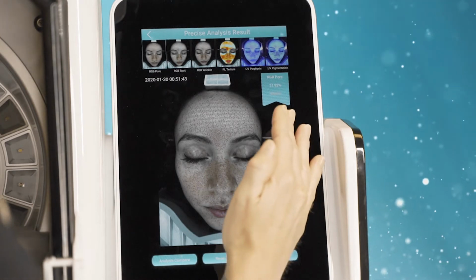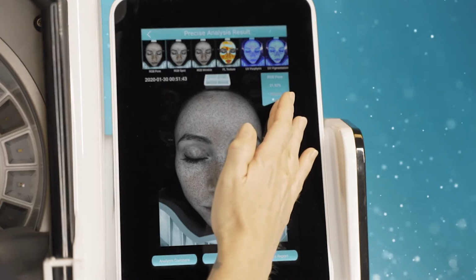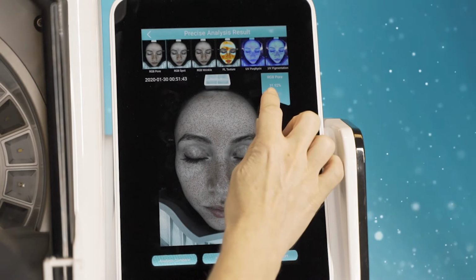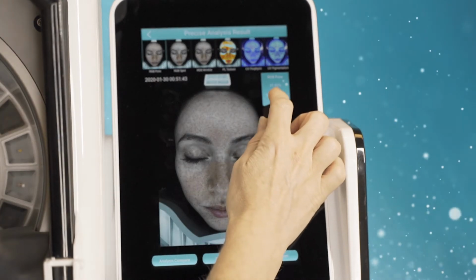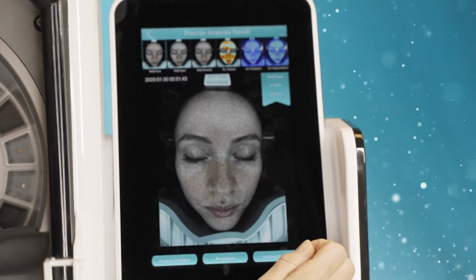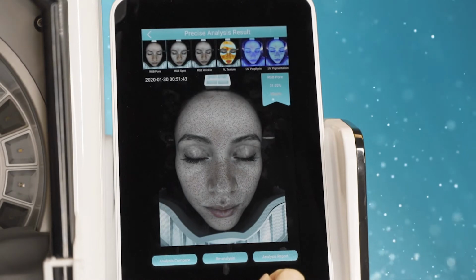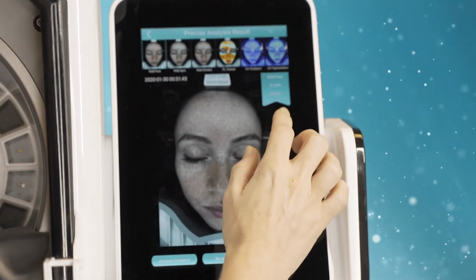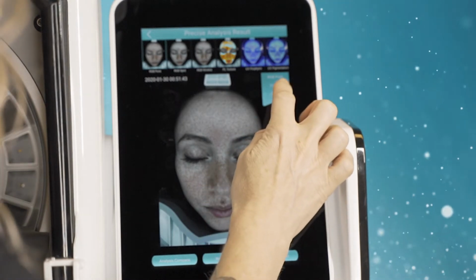If this was a percentage, it would be out of a whole, 100 being a whole. So 31 percentile is really not that bad, where 31 percentage is not so good. So make sure you explain the difference so our patients aren't concerned when they see this number.